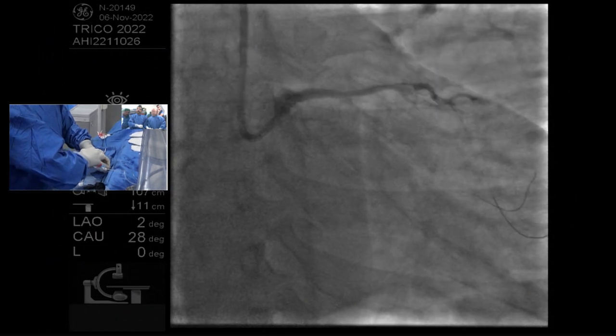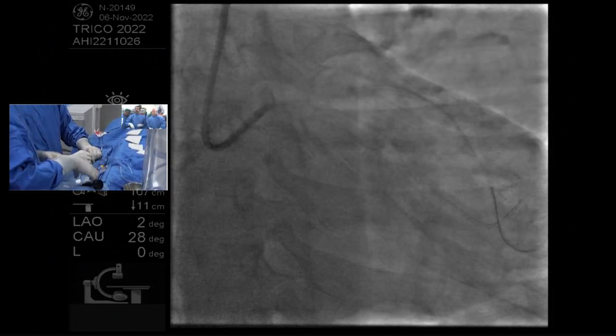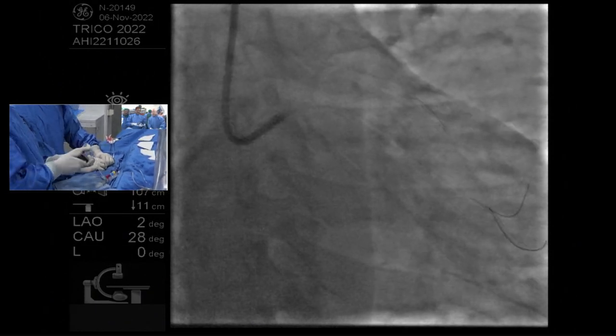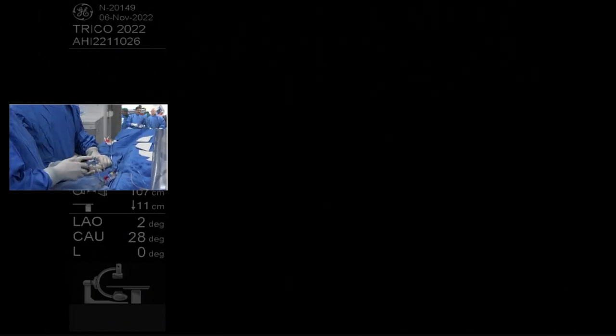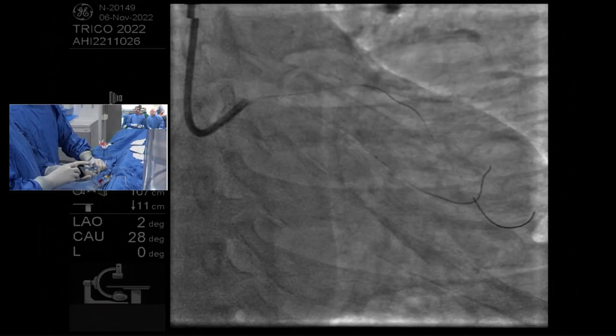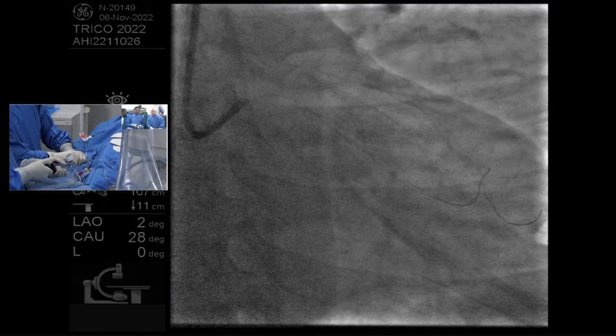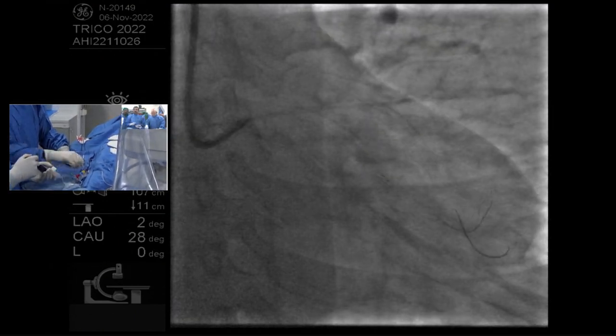Then in North America, we've got laser for those situations, with ablation, and finally the external cap crush where you dissect around the lesion, balloon on the subintimal wire, crush the calcium, 10, 12, and then cross on the intraluminal wire. Absolutely. Okay. Now, which was the balloon that you used to cross that tight lesion?